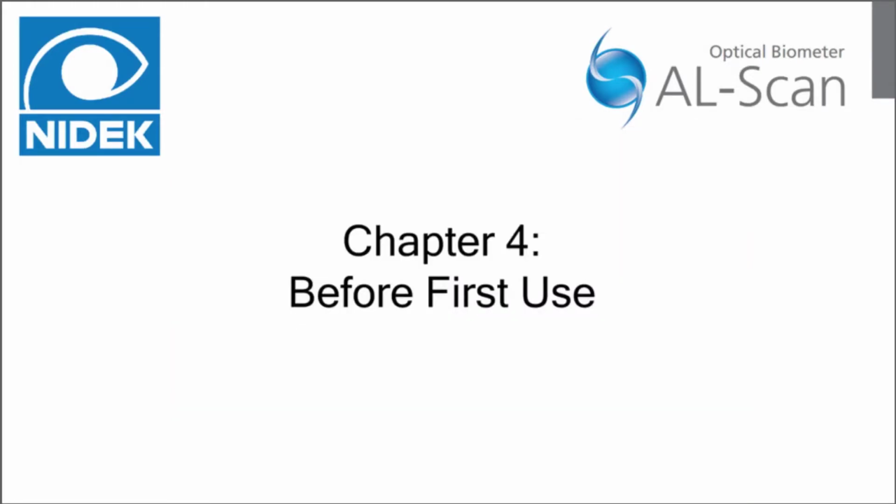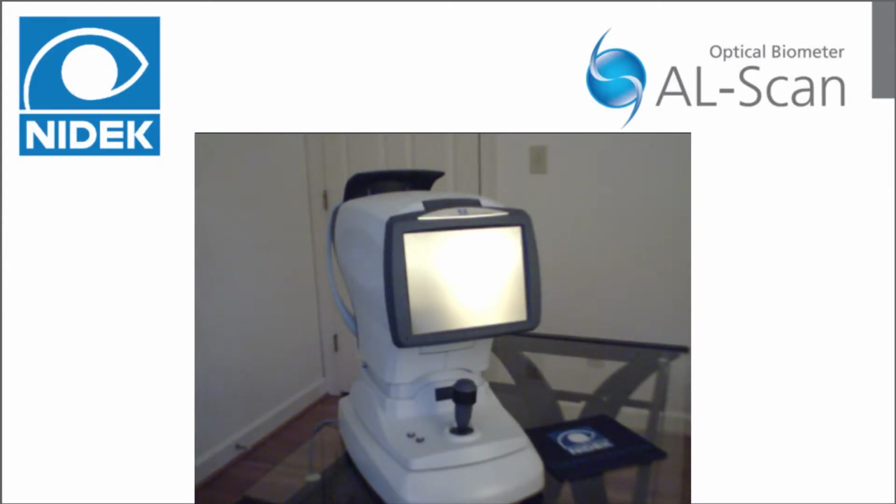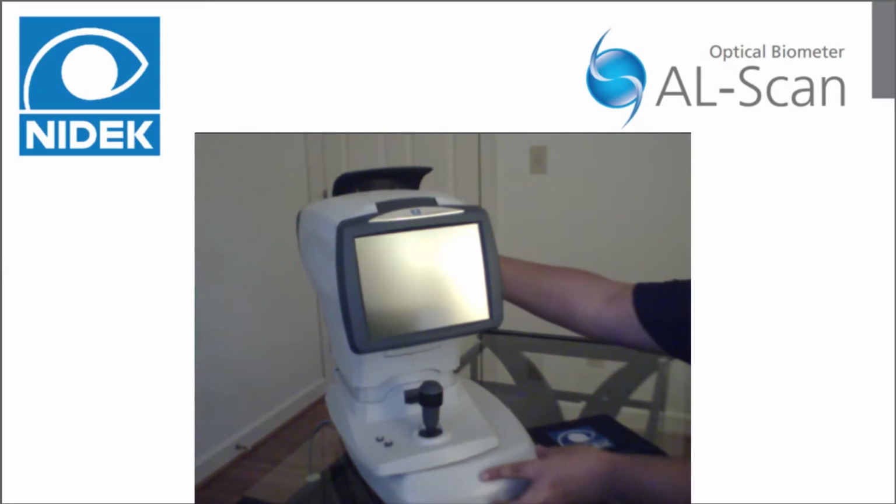Chapter 4, Before First Use. Place the device on a stable table. The device should be in a room with dimming lights. Move the base fully to one side and lock the main unit to the base unit with the locking lever. This allows you to lay the device down gently.